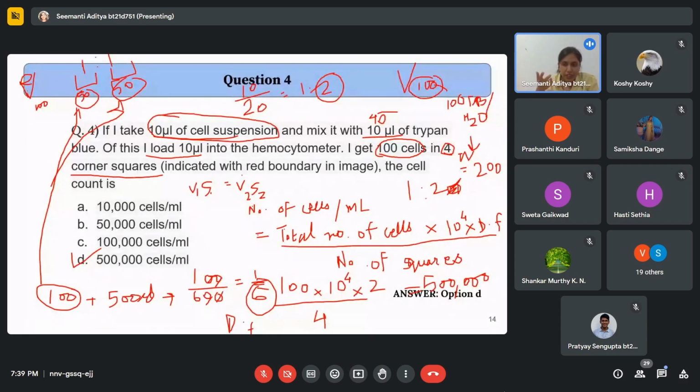And also a very practical problem that people can face is, for example, if you are seeding in 35 mm dishes, you can easily swirl the cells and properly mix the inoculum of cells with the rest of the media, so that the cells will be properly distributed. But for 96 well plate and 48 well plate, you cannot swirl the plates, because the area is very small.